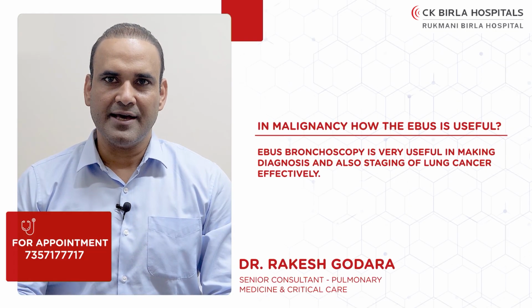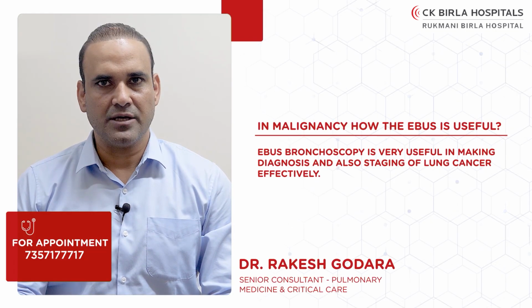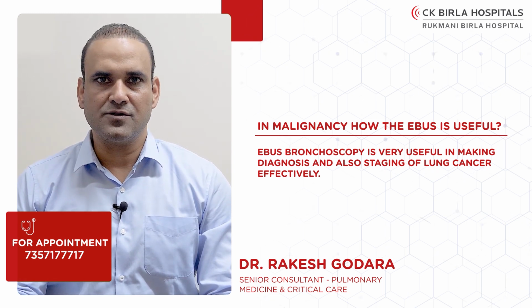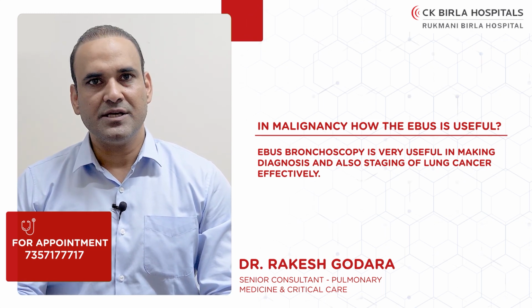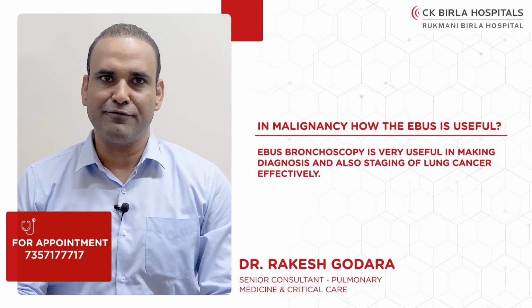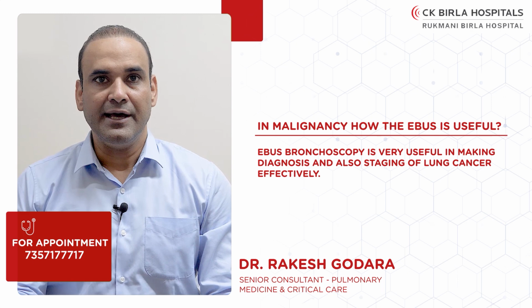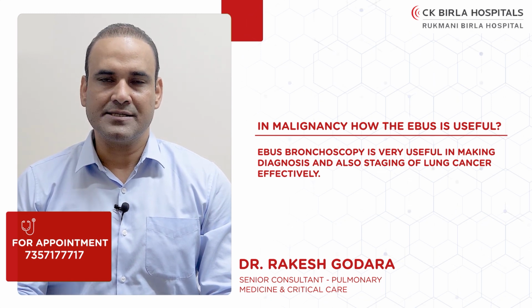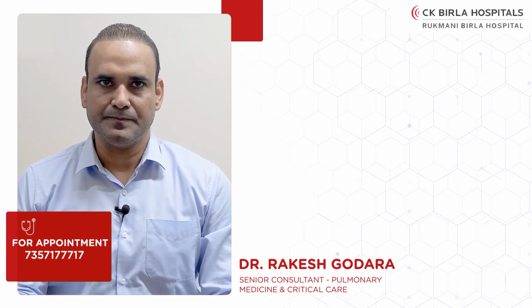EBUS bronchoscopy is very useful in making the diagnosis and also in staging of lung cancer effectively. In follow-up cases of malignancies, EBUS is useful in taking samples from PET-CT abnormal lymph nodes. Even enough tissue can be taken for further molecular analysis, and in this way it can avoid the need for surgical mediastinoscopy in most cases. How do we do EBUS bronchoscopy?